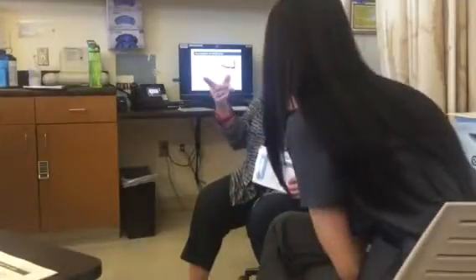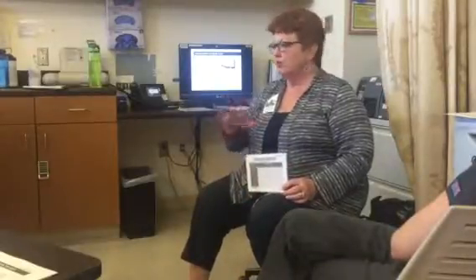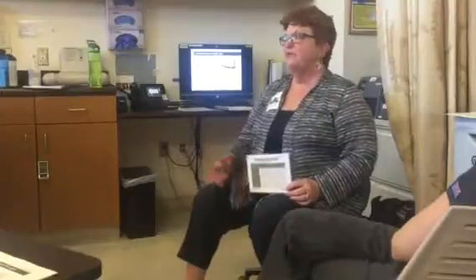They need a minimum volume, so you have to crank up the collect pump flow rate whether it's needed or not. Yeah, and that's not uncommon. You've got to do what you've got to do to get not only the cells in the bag, but the volume for that requirement. And the same with Dendreon. There's a volume requirement, but using a 1 milliliter collect pump flow rate for Dendreon on Optia has worked beautifully well. It's always gotten their minimum volume, as long as you can complete the rest.